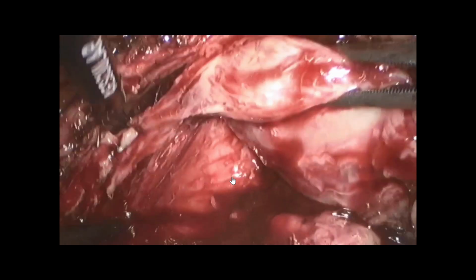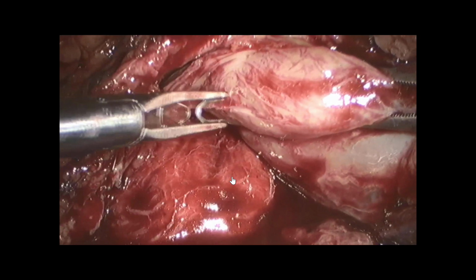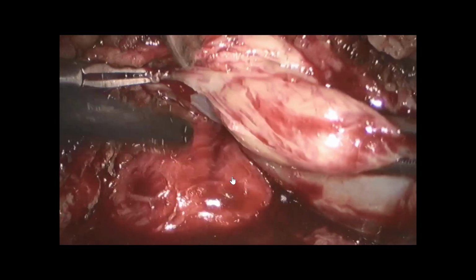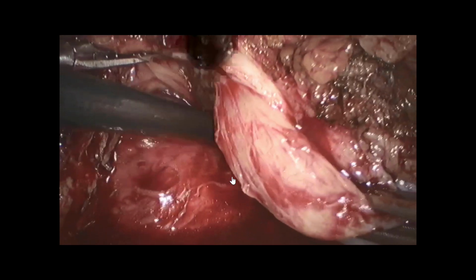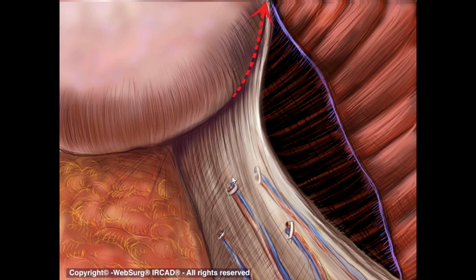And you turn, so you see here you have a typical aspect of artery penetrating the capsule, so you have to cut it, because if you don't cut it, you will have a positive margin. And then we arrive at the level of the apex. So it's quite finished. You see the puboprostatic ligament on both sides, and now it's quite finished.